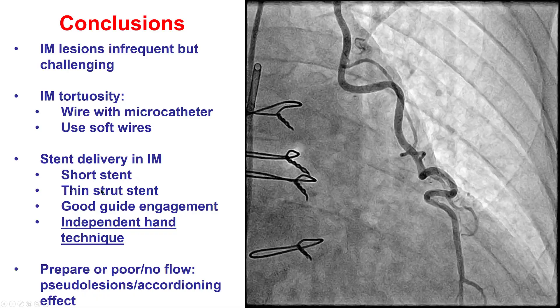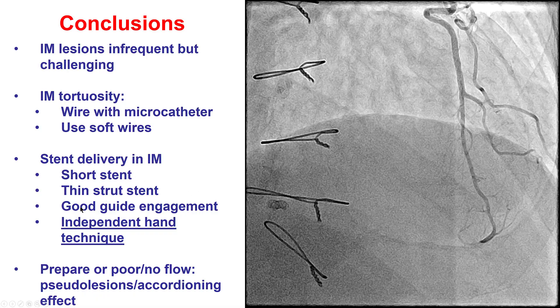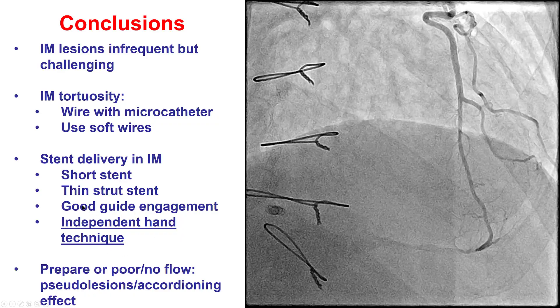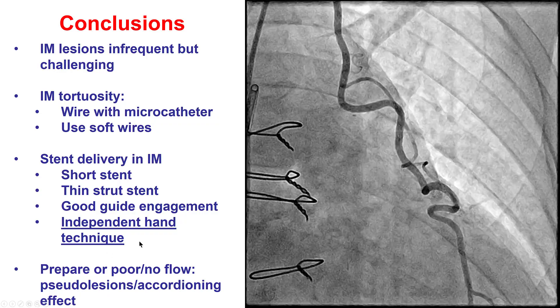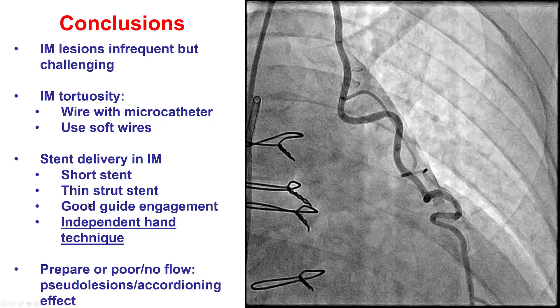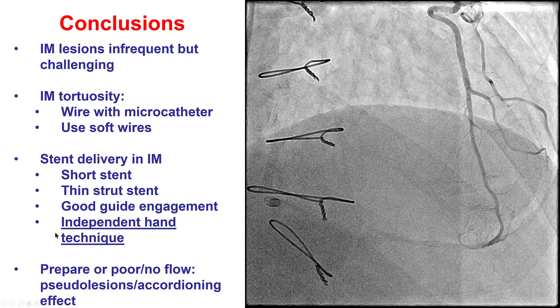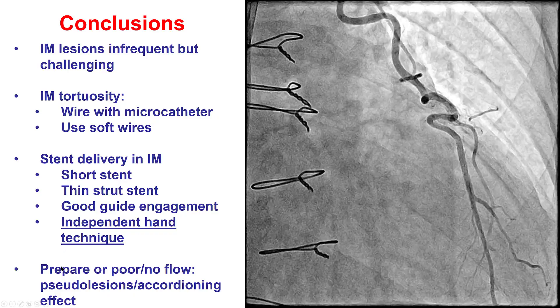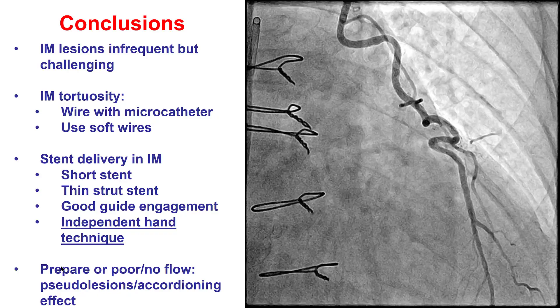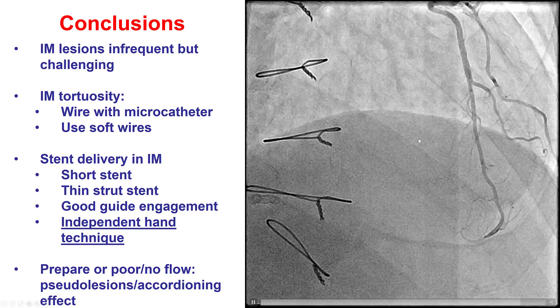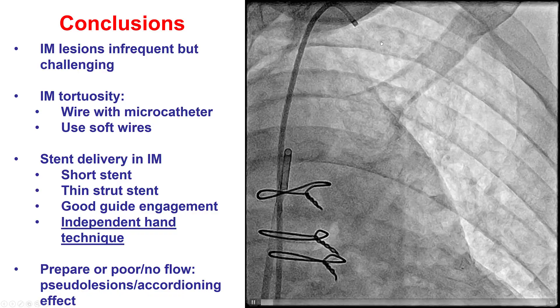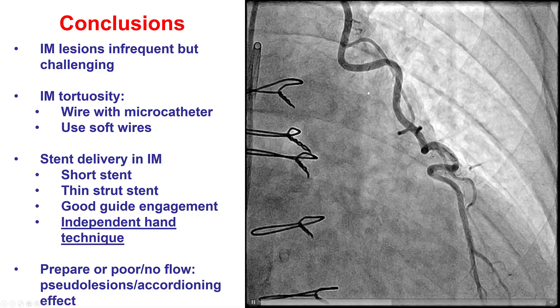Stent delivery can be challenging through these very tortuous grafts. One way to overcome this is to use a short, thin strut stent, prepare the lesion well, and have good guide engagement. Most importantly for this case, use the independent hand technique — having the left hand truly support the guide and prevent backward movement, while using the right hand to push the stent to the desired location. If there is poor flow, that can be a problem and we may have to give up position and let the vessel resume antegrade flow. But for a few minutes, as it happened in this case, patients can often tolerate this, and the procedure was successfully completed. Thank you.